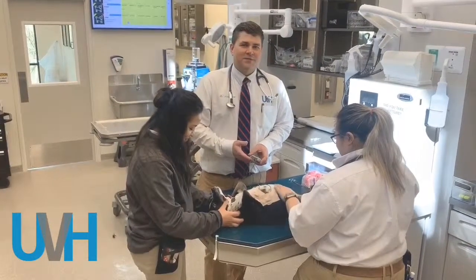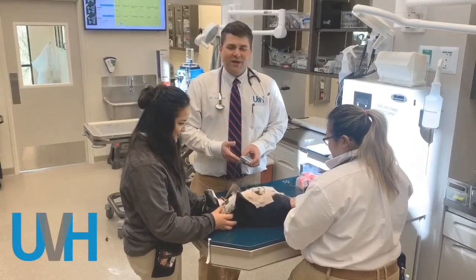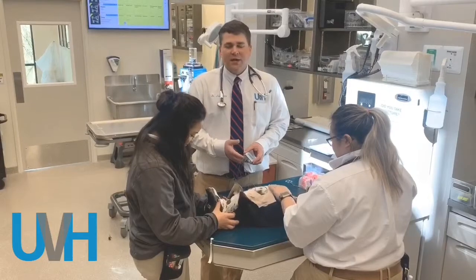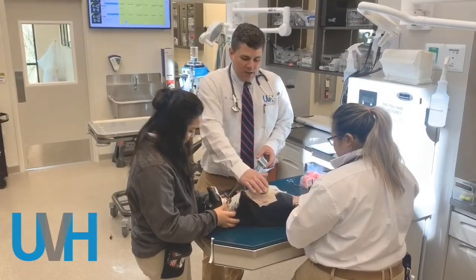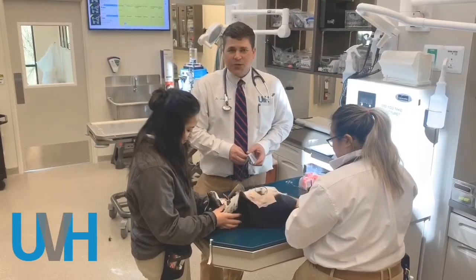Hey, it's Dr. Adam Poirier with UVH Behind the Scenes, and today we're putting on a Holter monitor. This is a pretty cool device — it's used in people as well as in dogs and cats, but in this case we're using it in a dog. This sweet little dog has a rhythm issue, and so we're trying to figure that out.